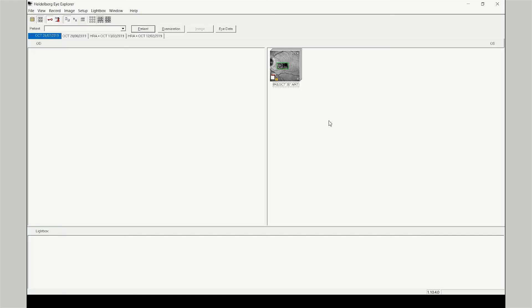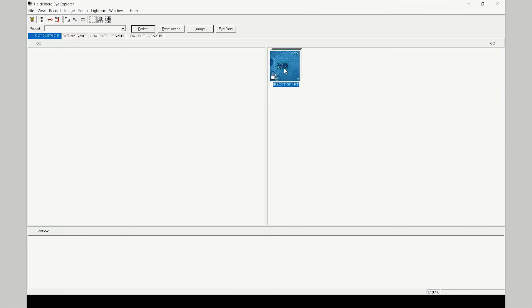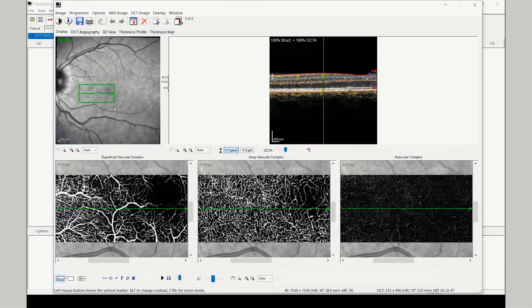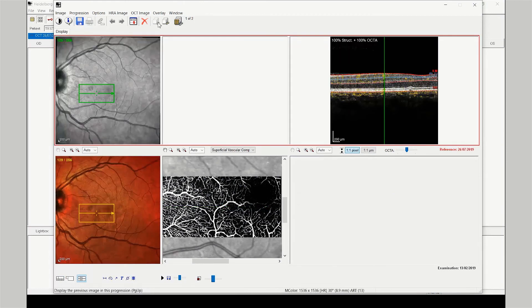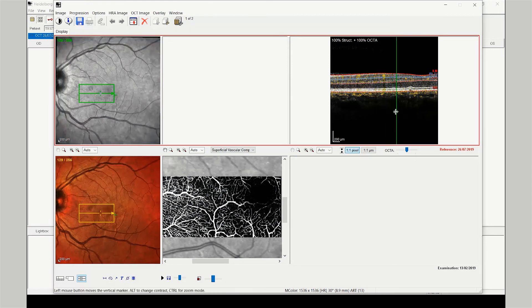To review the OCTA scan acquired with the scan planning tool, open the thumbnail image. From the display tab, compare two scans side by side and navigate backwards in time to display the reference image. Comparisons between the historical fundus image and the OCTA scan can now be made.